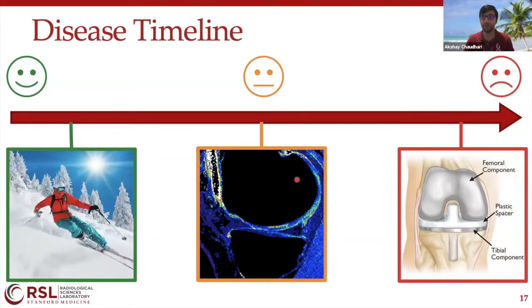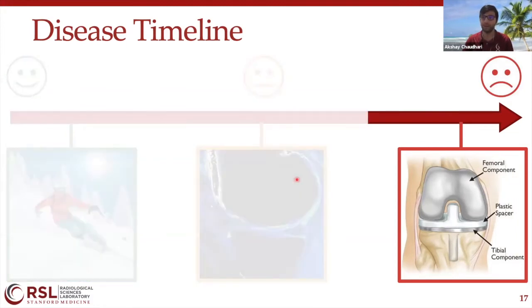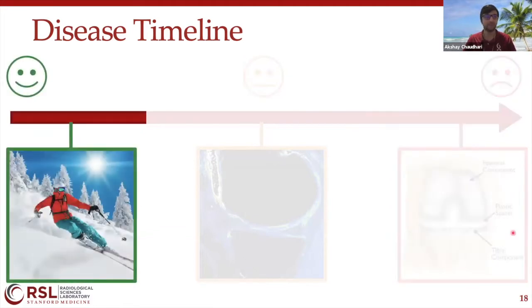And the fundamental reason here is that we really cannot do this from a healthcare perspective just because our imaging takes too long. So we cannot prescribe everyone with knee pain to go get an MRI scan done. And because of this, the way our healthcare system essentially is lined up is we only end up treating very late stage disease, when in fact our focus should be looking at the very earliest manifestations of what the disease looks like so that we don't have to wait for it to get too bad and we can intervene much earlier in the process.